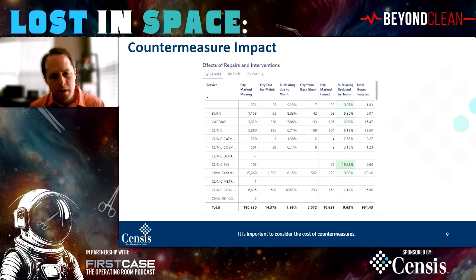The other thing that you can measure is how many instruments are you having to pull from backstock or a pegboard to fill in holes coming down in trays. So what is the remaining opportunity ahead of you? So you can add up or estimate the cost for all of those instruments. You can then look at that cost by service line, by tray, by kind of instrument.